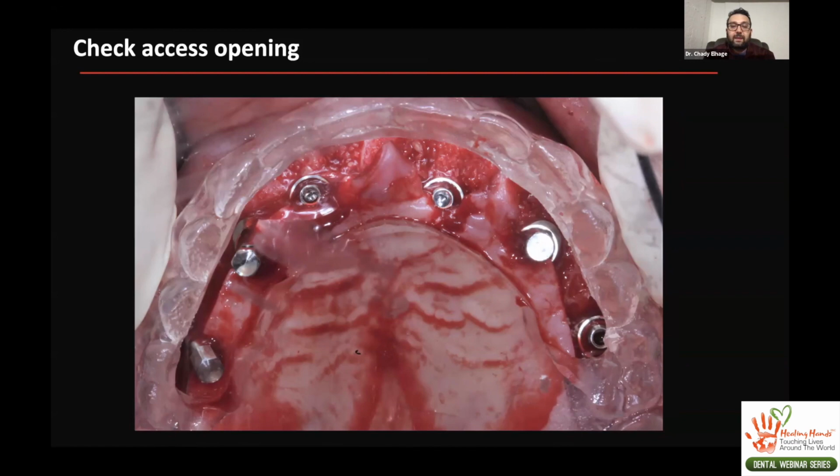I will tell you, I've come across several folks that do this later on, 4 to 6 months after the implants are placed. I've never done that. We place the abutments at the time of surgery because they're torqued in and then bone is filled in there. If you try to do it later and you get some bone growth over your implant, sometimes you have to go in there and remove a little bit of that bone so that you can seat that abutment. In these cases, the bone will actually grow up under the abutment.